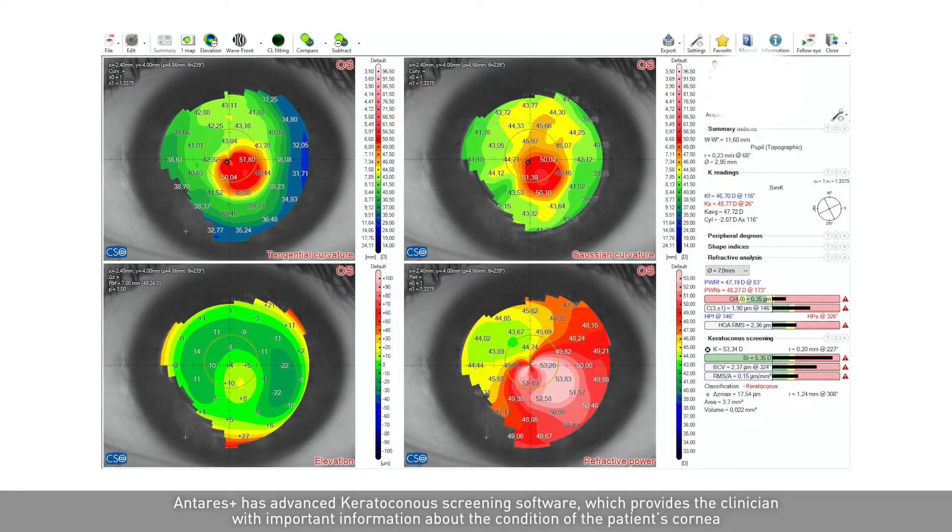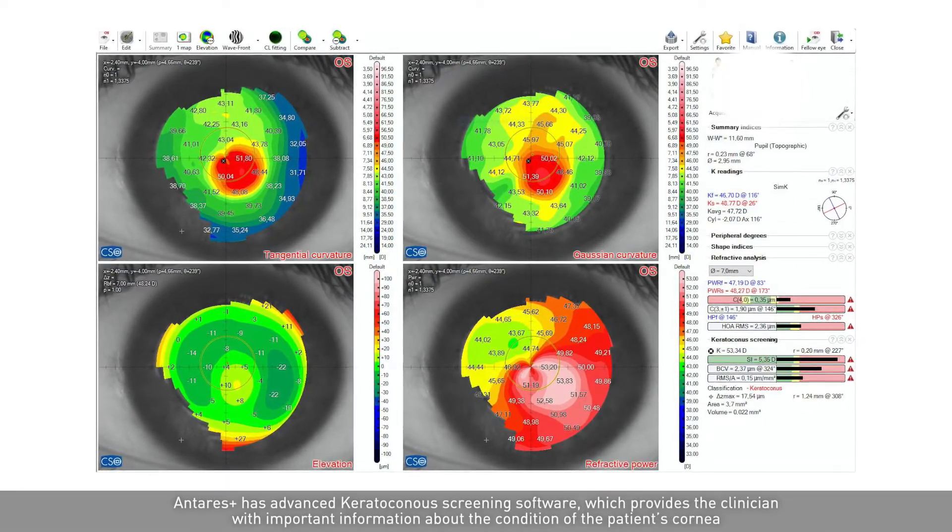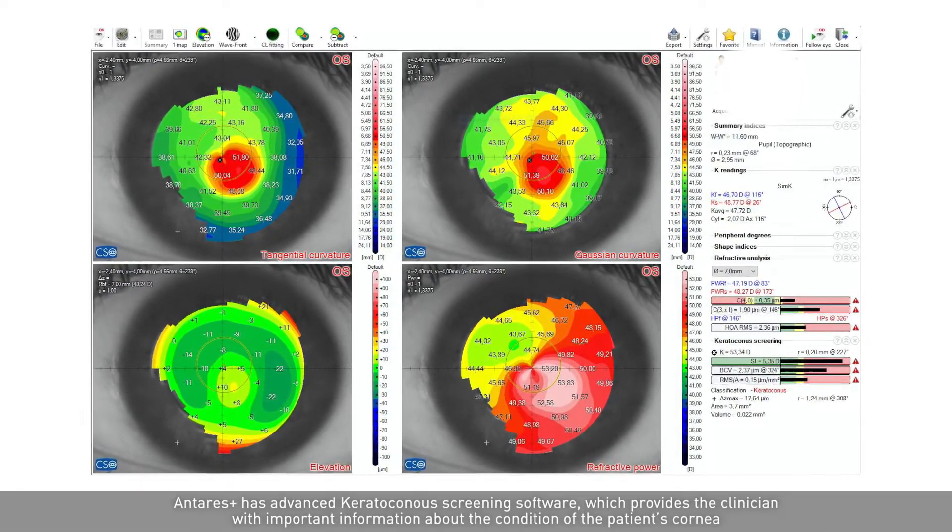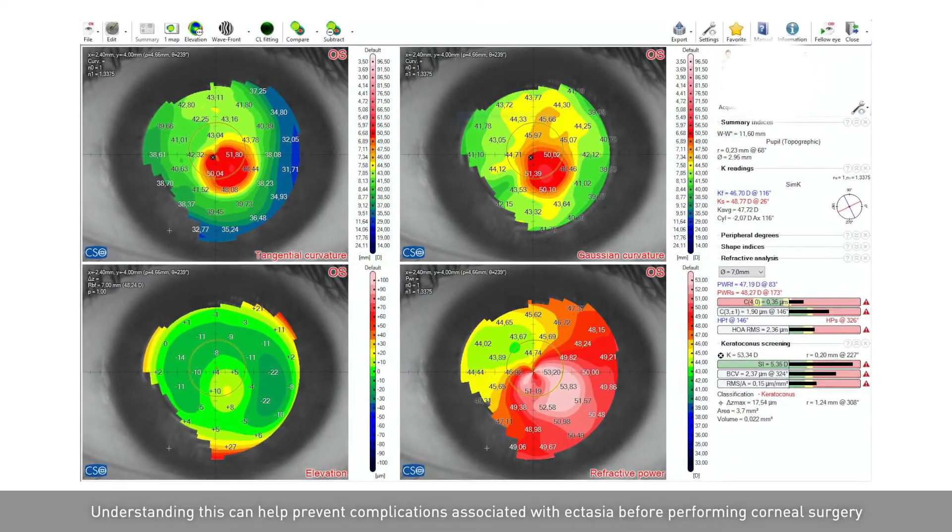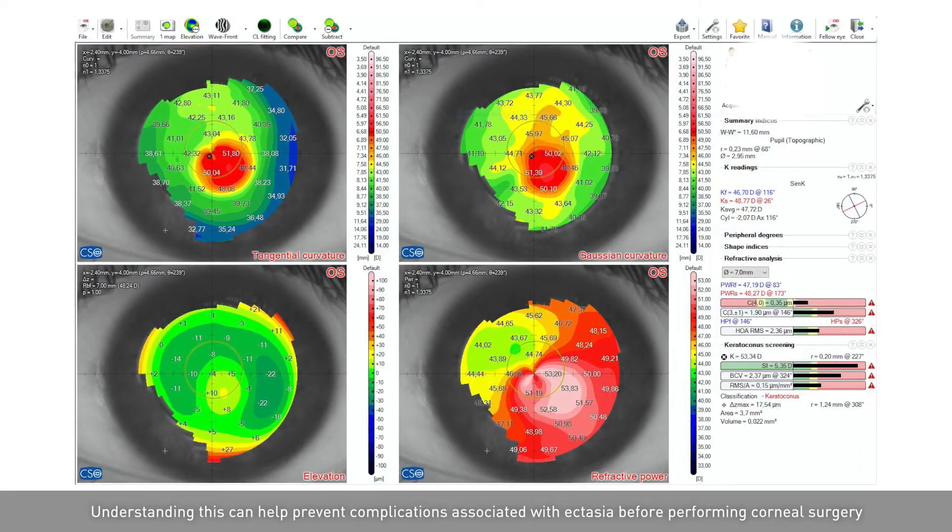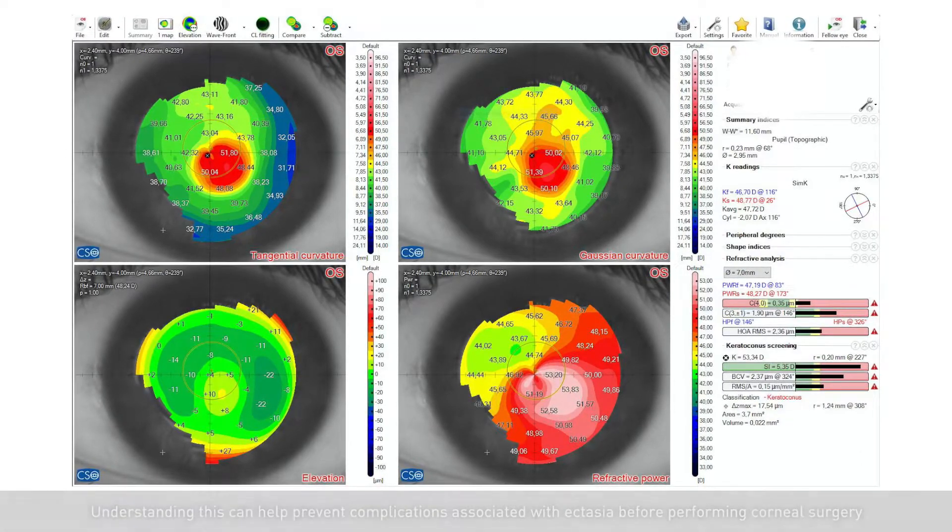Antares+ has advanced keratoconus screening software, which provides the clinician with important information about the condition of the patient's cornea. Understanding this can help prevent complications associated with ectasia before performing corneal surgery.